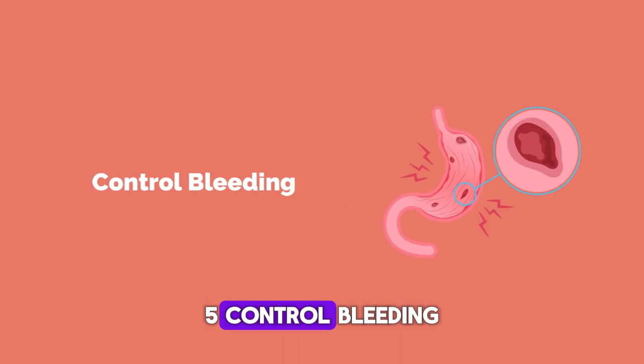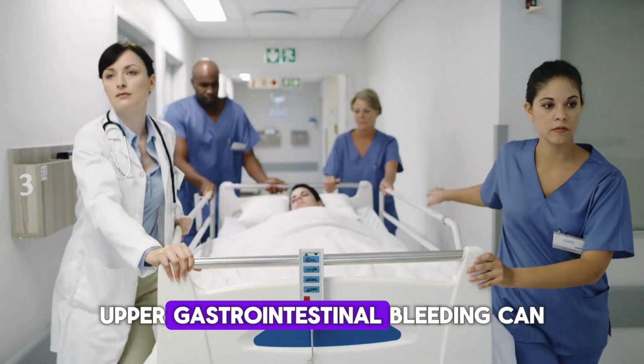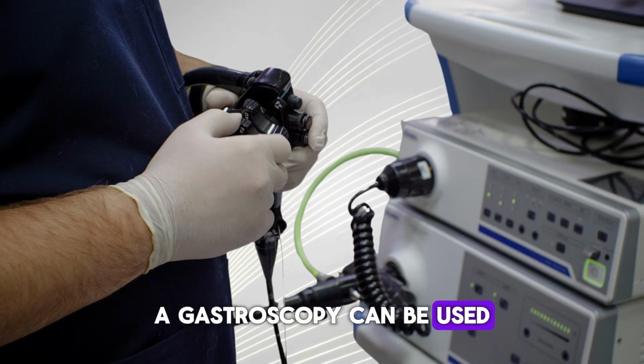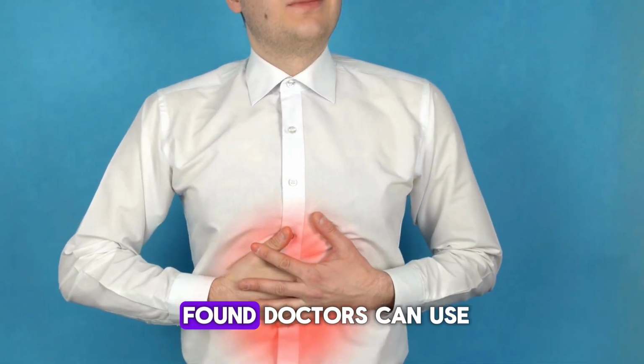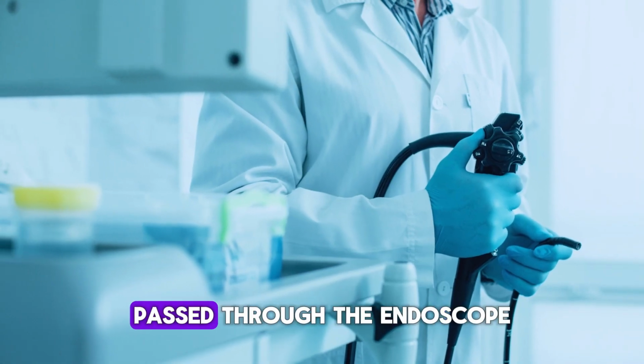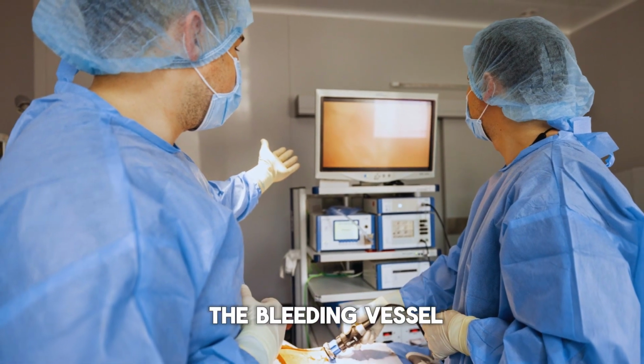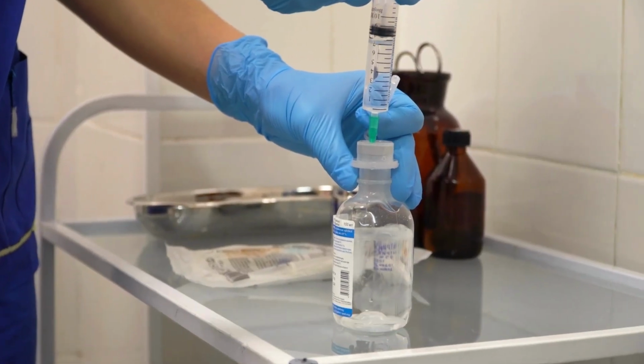5. Control bleeding. Upper gastrointestinal bleeding can be life-threatening. A gastroscopy can be used to locate the source of the bleeding. Once the source is found, doctors can use special tools passed through the endoscope to stop the bleeding, such as by cauterizing the bleeding vessel or injecting medications.